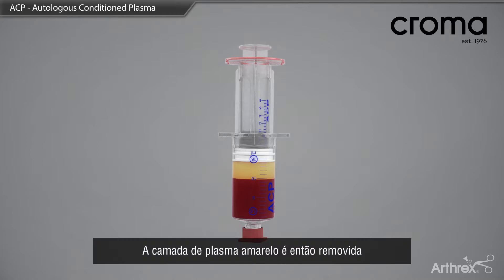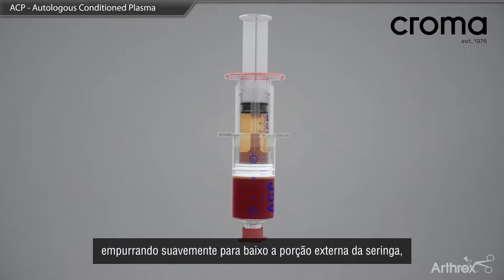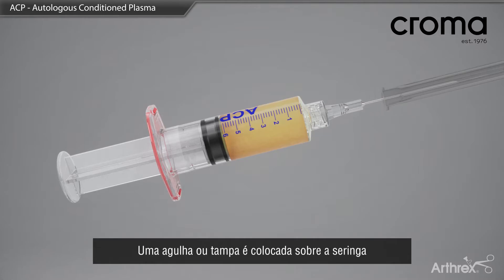The yellow plasma layer is then removed by gently pushing down on the outer portion of the syringe, while pulling back on the innermost plunger. The inner syringe is then twisted in a counterclockwise direction and removed. A needle or cap is placed on the syringe for use at the point of care.